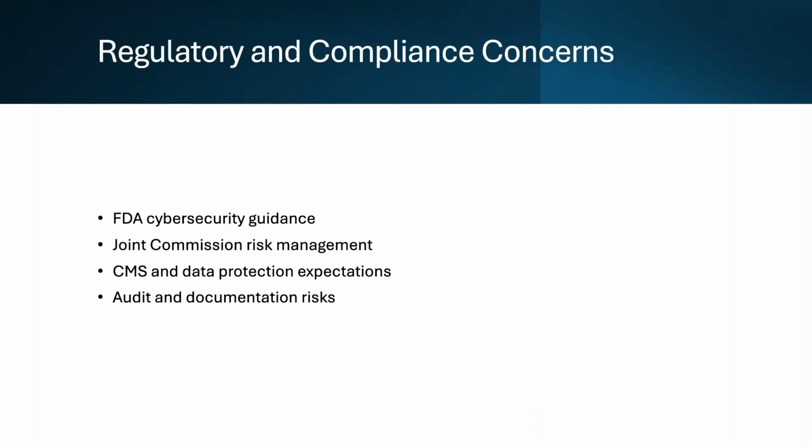This slide covers the regulatory and compliance concerns tied to medical devices with embedded operating systems, and these are increasingly important as regulators focus more attention on cybersecurity. First, the FDA provides cybersecurity guidance that stresses proactive risk management, secure design, and timely updates. The FDA expects manufacturers and healthcare facilities to identify cybersecurity risks and implement mitigation strategies. Failing to follow these recommendations can lead to enforcement actions, device recalls, or restrictions on use.